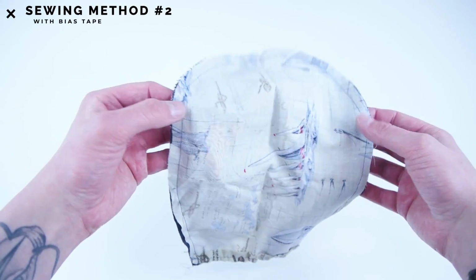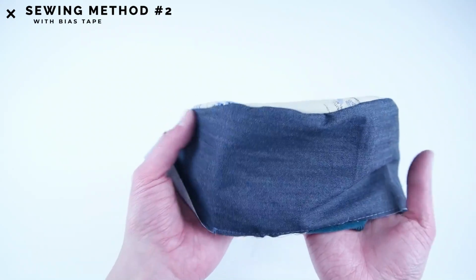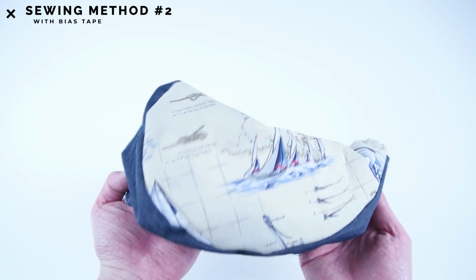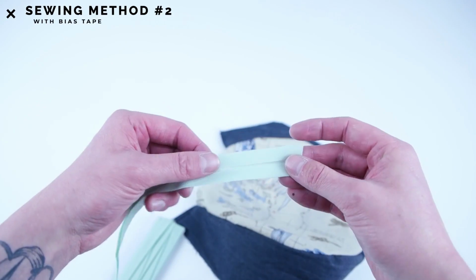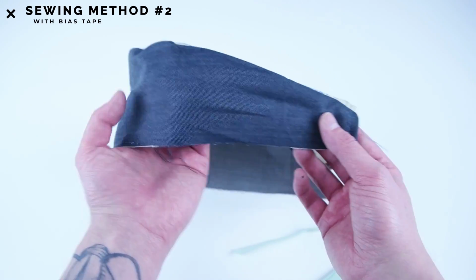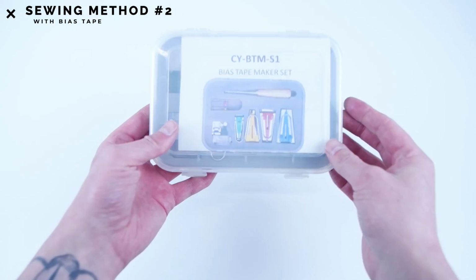You can snip notches around the curve to reduce the bulk. At this point, I like to flip it right side out and check all the edges, make sure all the layers got sewn together. We're going to be adding bias tape along the entire bottom edge, and we're going to leave about 5 to 6 inches sticking out to act as the ties. And you can either use pre-made bias tape or make your own with the bias making kit.